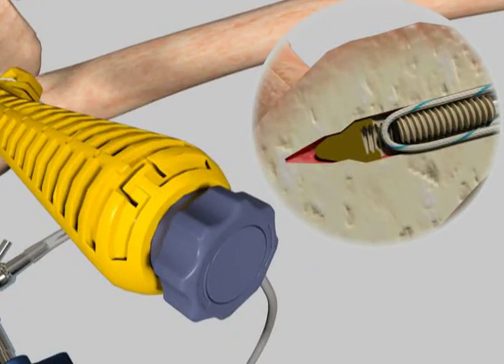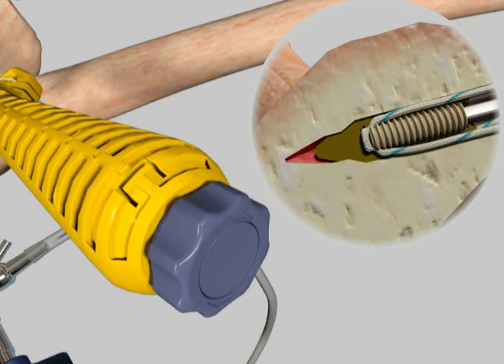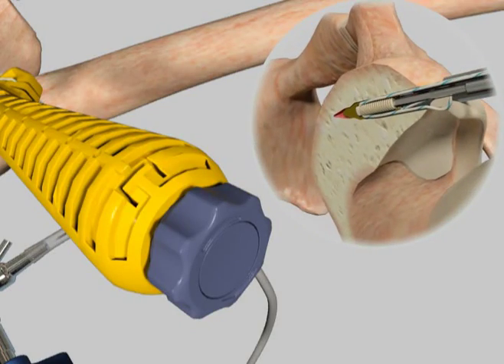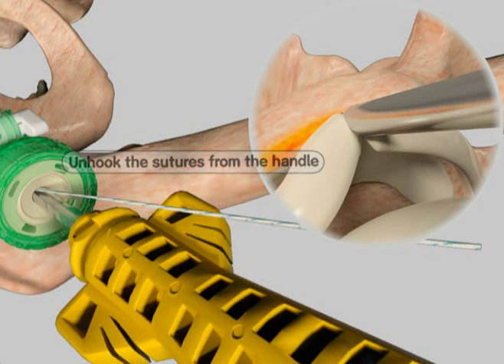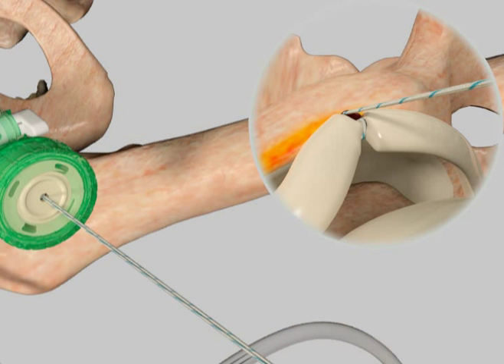Once tight, rotate the torque limiter on the end of the handle clockwise about 8 turns until several clicks are heard to lock the sutures into place. To finish, unhook the sutures from the handle and disengage the handle from the anchor by pulling straight back or tapping the distal end with a mallet. Discard the insertion device.